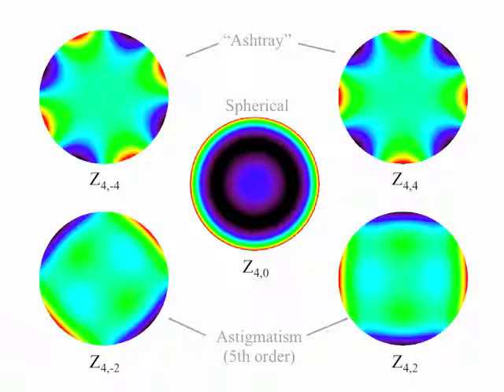Fifth-order Zernike polynomials are sometimes given names, but they're of less relevance clinically. These are further ways that the wavefront can be distorted. And in the same way that we're not going to see a perfectly planar wavefront, we're not going to see a perfectly spherical wavefront or an astigmatic wavefront that's perfect in that sense either. We're also not going to see perfect trefoil. We're not going to see perfect fifth or sixth or nth order Zernike polynomials.